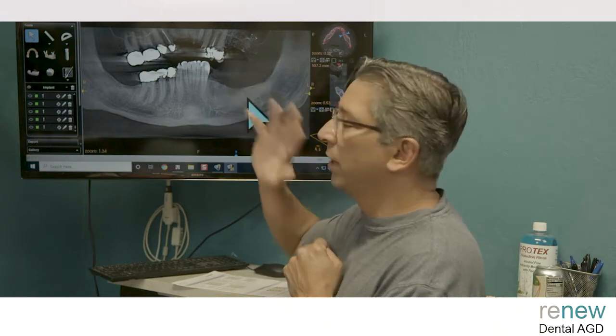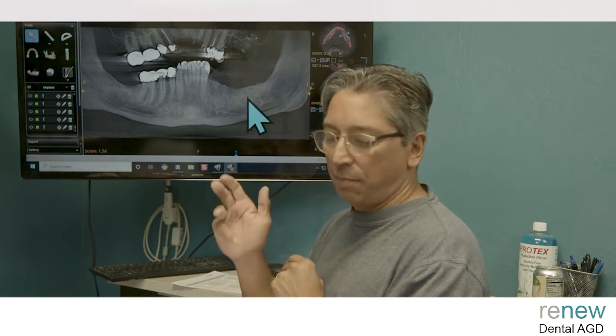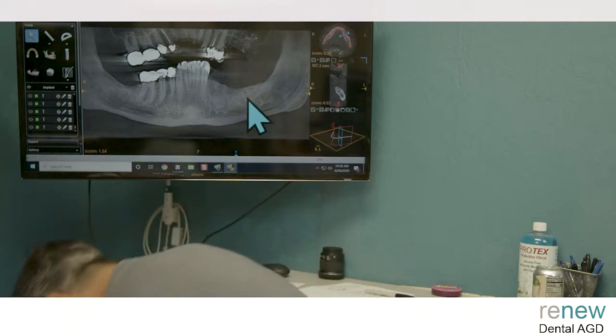Anyway, so we've got a canine here, and we're looking at what we are going to do across here. So you're looking at 3 functional teeth here. We're looking at tooth numbers. Let's see. Hold on, we have to start again.